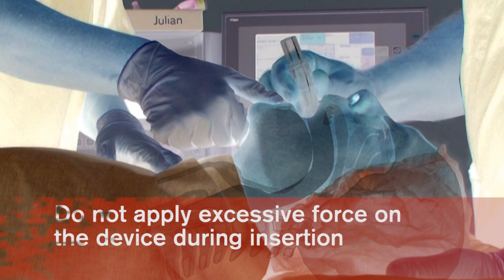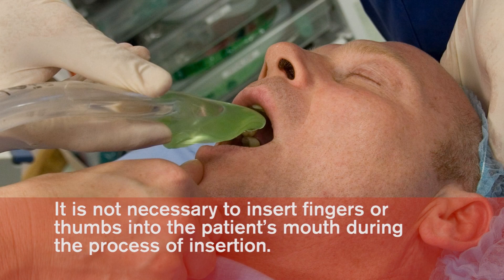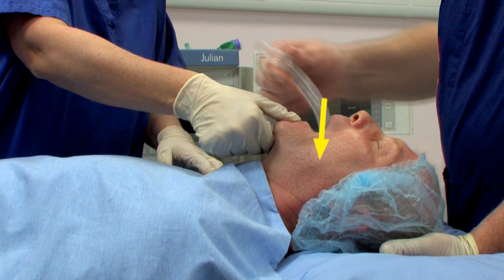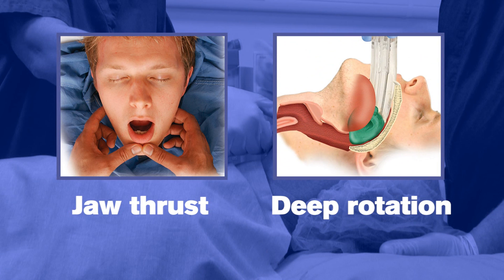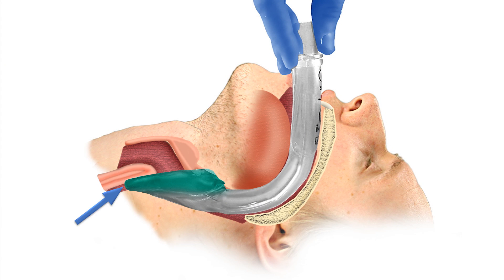Glide the device downwards and backwards along the hard palate with a continuous but gentle push until a definitive resistance is felt. Do not apply excessive force on the device during insertion. It is not necessary to insert fingers or thumbs into the patient's mouth during the process of insertion. If there is early resistance during insertion, a jaw thrust or insertion with deep rotation is recommended. When inserted to a definitive resistance, the tip of the iGel should be located into the upper esophageal opening and the cuff should be located against the laryngeal framework.